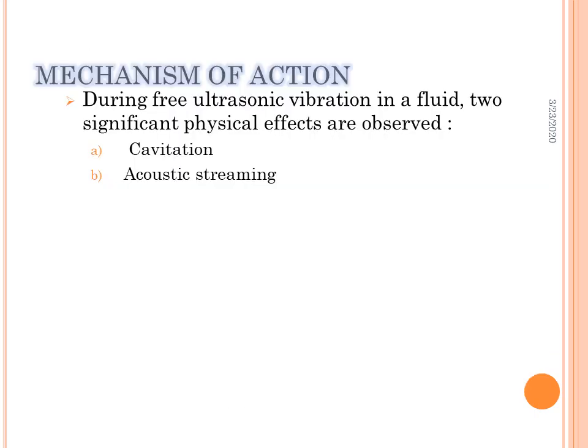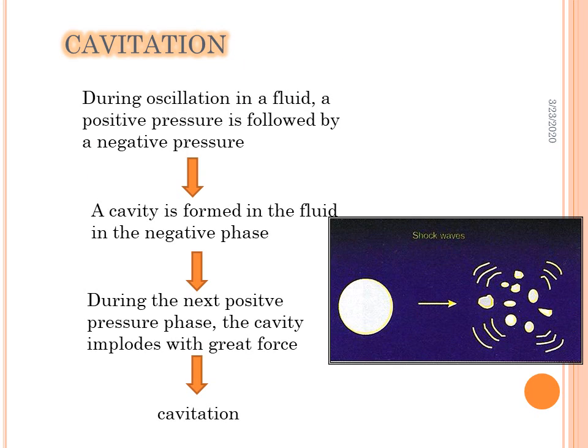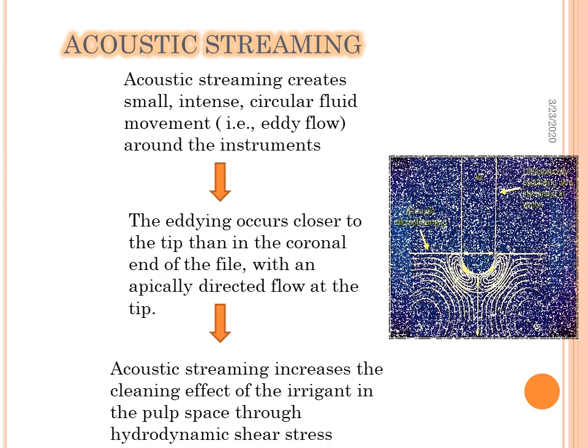So now there are two mechanisms of action by which the ultrasonics work. This is in terms of the irrigation capabilities. So how to act also, I'll just give you a brief outline. Basically, cavitation is the process by which energy is released when small bubbles are formed in the liquid and when these bubbles implode. So basically, when you are irrigating into the root canal, there will be the presence of small bubbles.